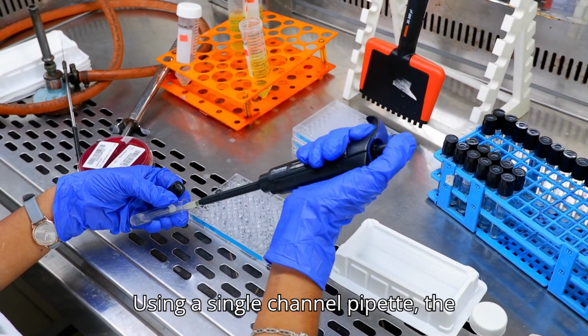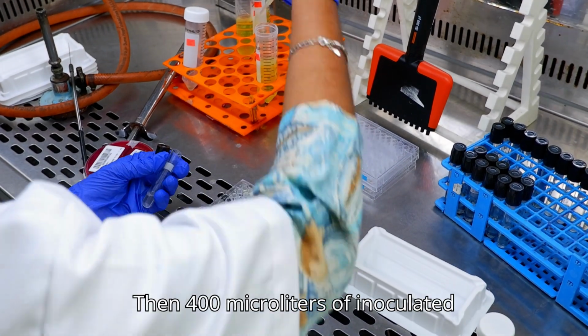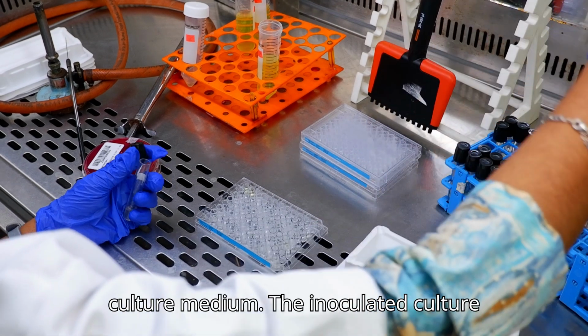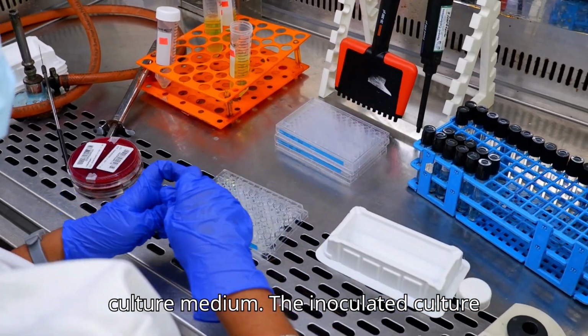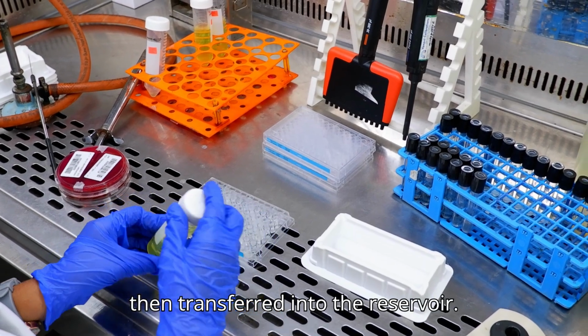Using a single-channel pipette, the bacterial suspension is mixed thoroughly. Then 400 microliters of inoculated peptone water is added to the fluorescent culture medium. The inoculated culture medium is mixed gently. The medium is then transferred into the reservoir.